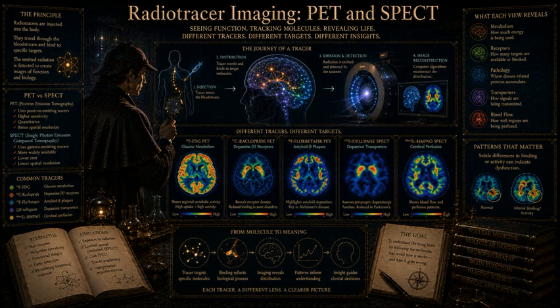Give me a specific narrative example of how imaging directly solved a clinical trial mystery. The textbook tells the Pindolol story, and I think it perfectly encapsulates the power of PET. The Pindolol story is a classic example of radiotracer imaging saving a theory from premature death.